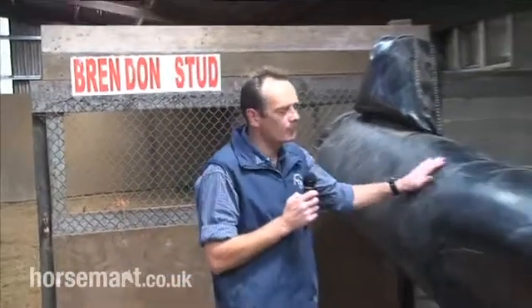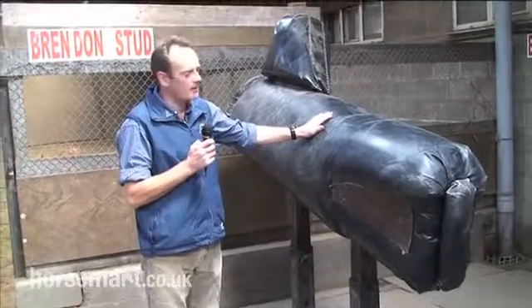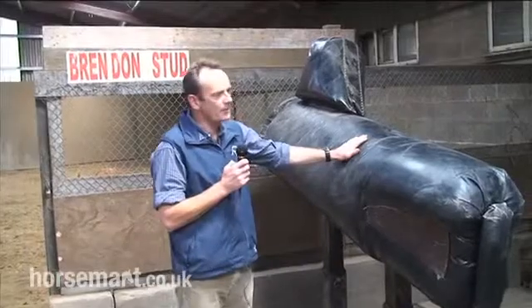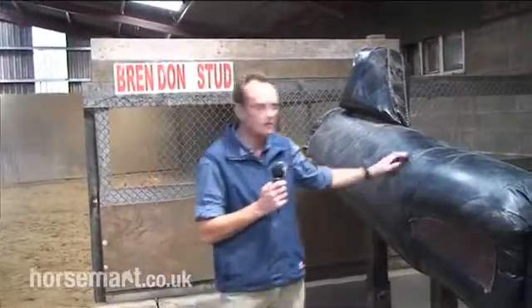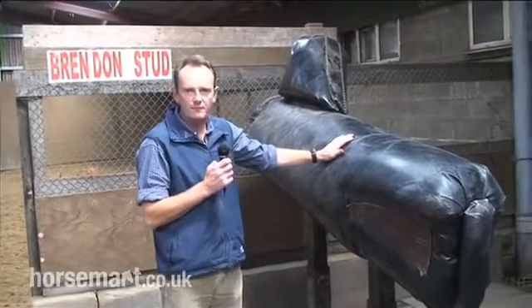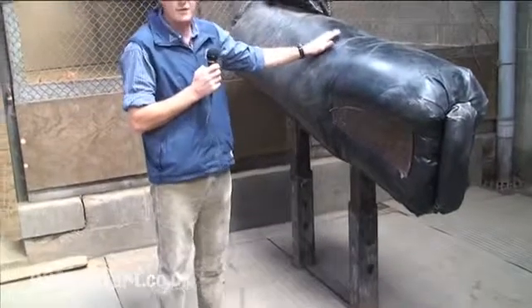We're here in the stallion collection area at Brendan Stud. The most important piece of equipment is our phantom mare, affectionately known at the stud as Plastic Pam. We use a phantom mare rather than a mare that is in season for the stallion to mount — the idea being that we don't have any misbehaviour, we don't have safety issues, and we don't have to worry about the mares being in season.